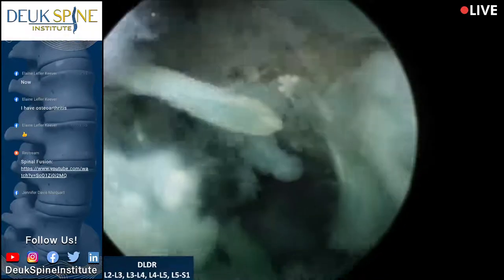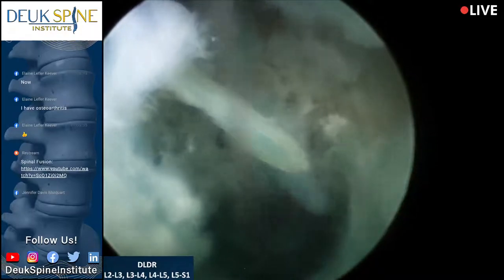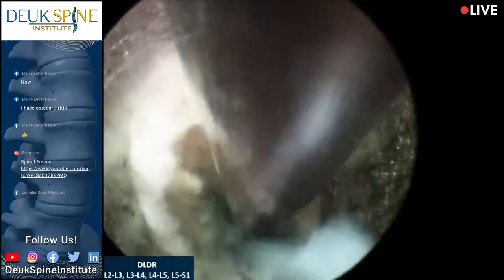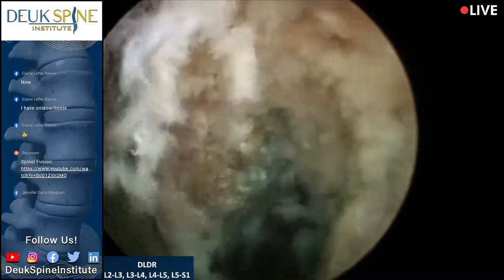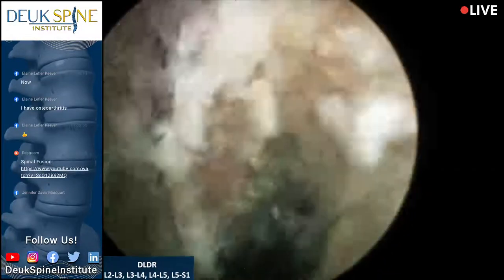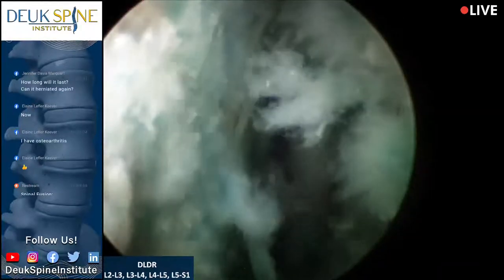All right, grab her. You guys doing all right? Patient's okay? All right, so again, you can see it's bone on bone here. So whoever asked that question, I want you to look at this disc. There's bone, all this junk. Sorry, let me get rid of this stuff. It's supposed to wash out.